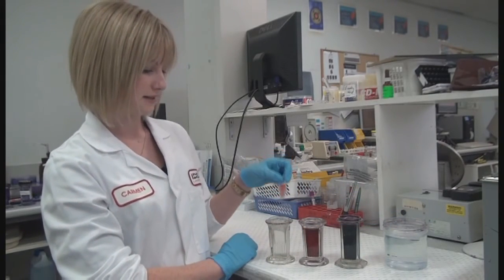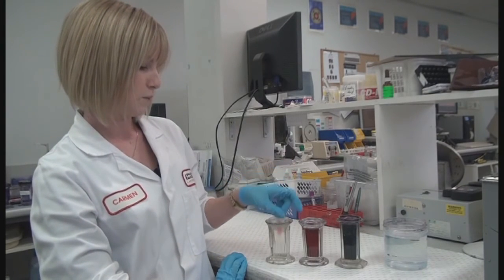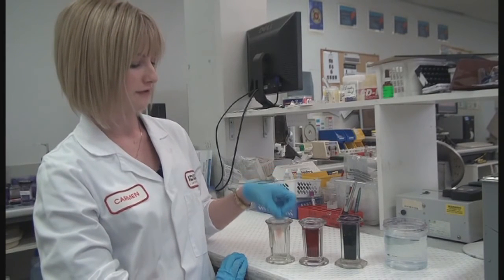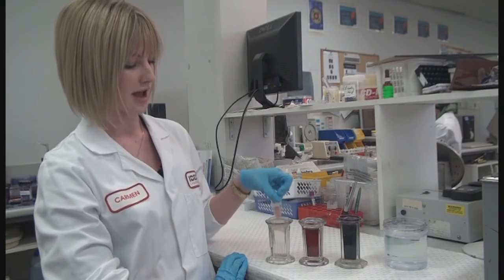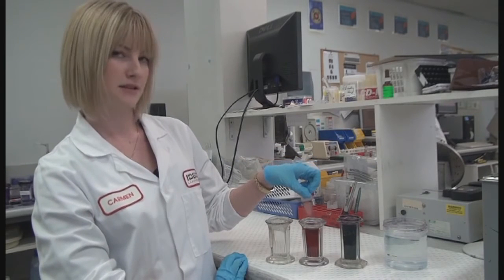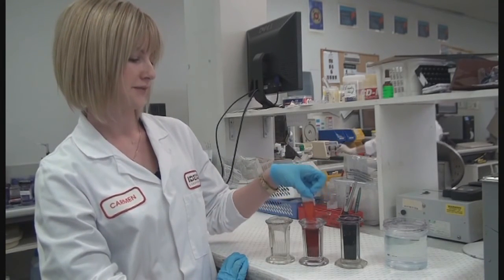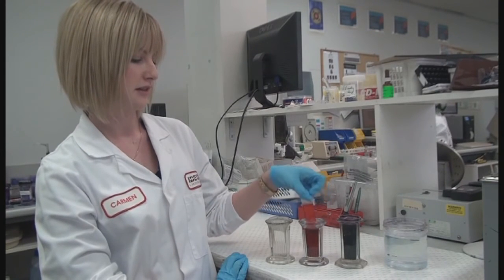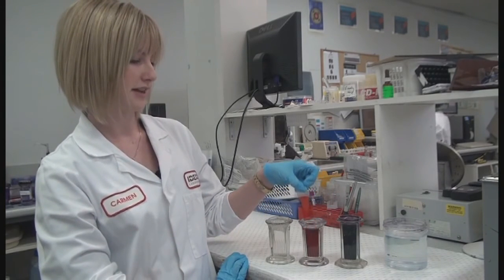So the first step is 10 dips in the fixative. Drain off the excess. 10 dips in dip 1. Drain off the excess.